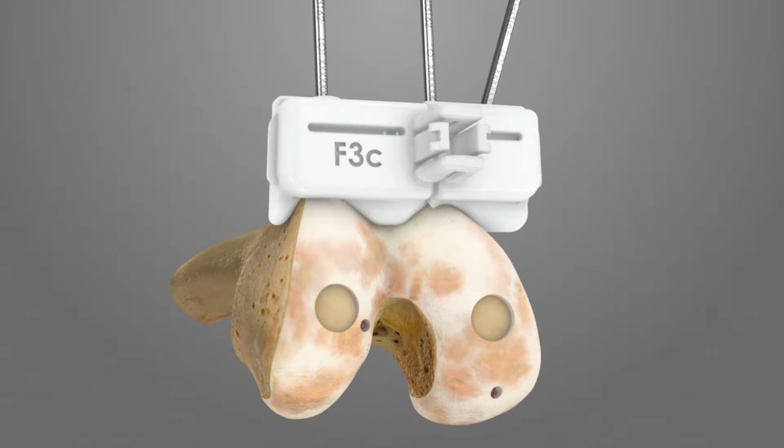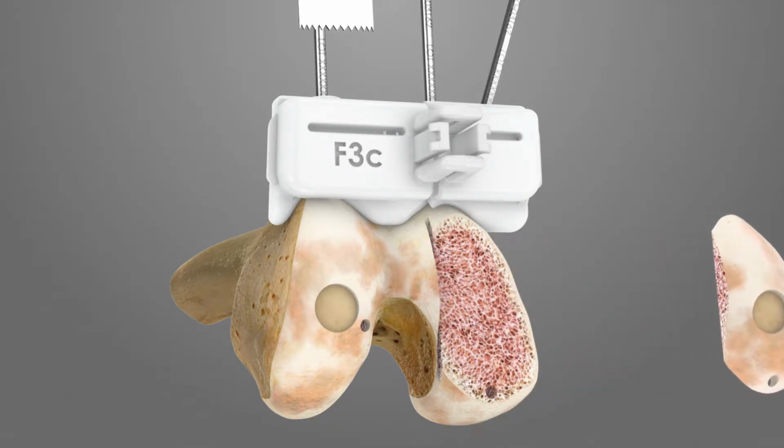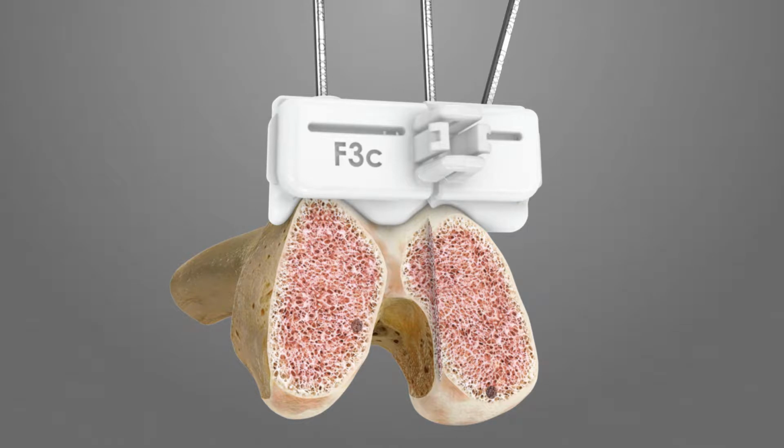The F3C iJig has a patient-specific surface that extends over the trochlea and may or may not have a step cut depending on which option preserves the most bone. If a step cut is present, use a reciprocating saw blade along the step to complete the cut. Next, use the oscillating saw blade to complete the distal medial and lateral resections. Make sure that the saw blade is at a slight angle when inserting it into the captured slot. The saw blade must touch bone prior to the initiation of the saw blade.